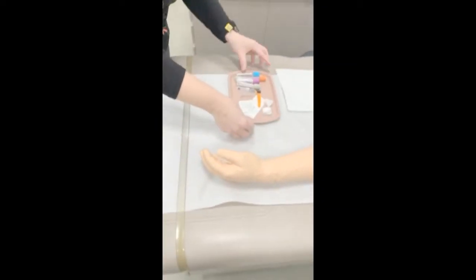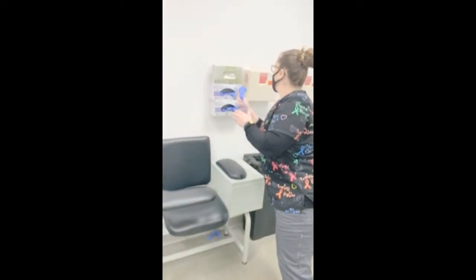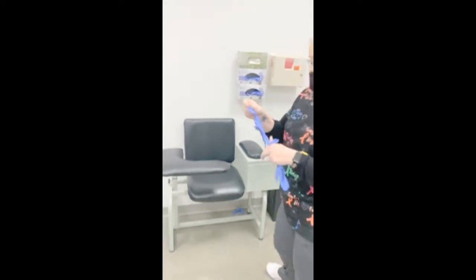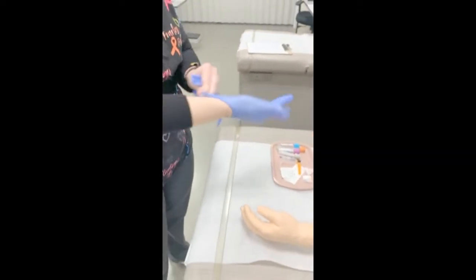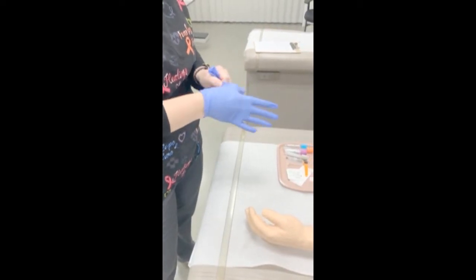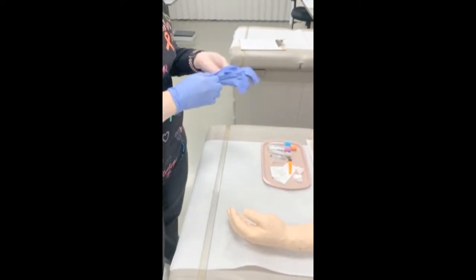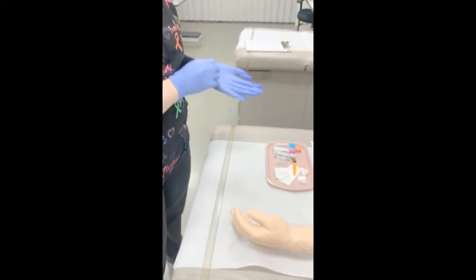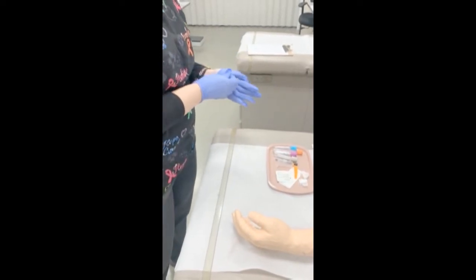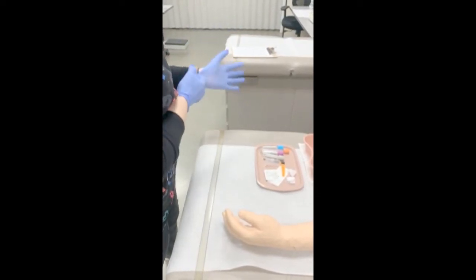She'll go ahead and grab her gloves. You can see she's having a little bit of a hard time putting on her gloves — this can be easily remedied with a little bit of baby powder, which most labs have. It will help the gloves slide on a little bit easier. Making small talk with your patients is always a good idea; it helps to make them comfortable and helps the blood draw go much more easily and efficiently.